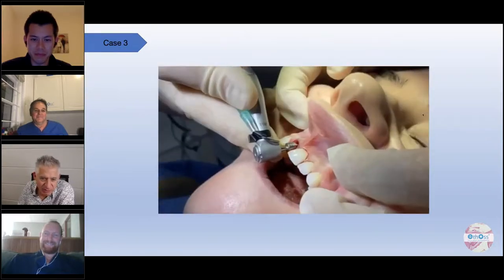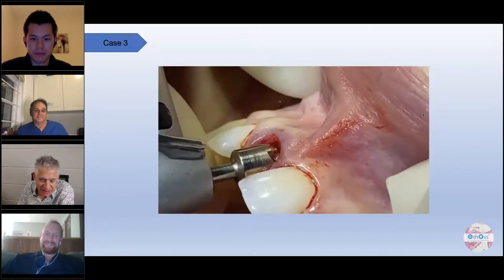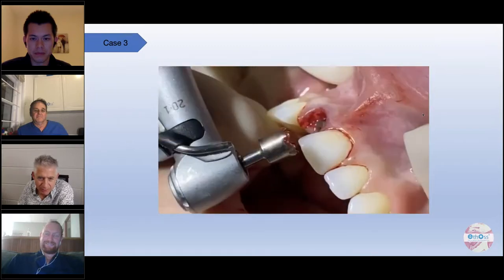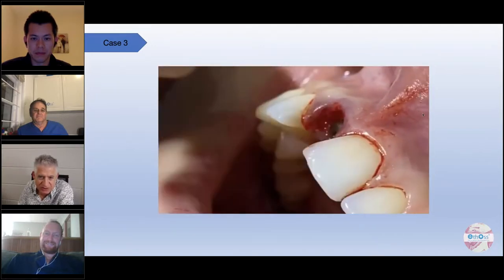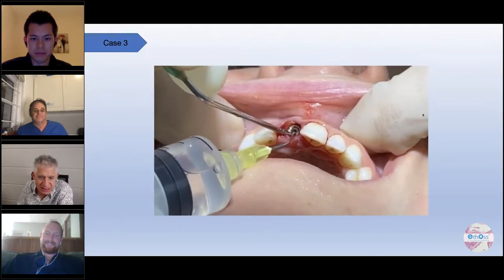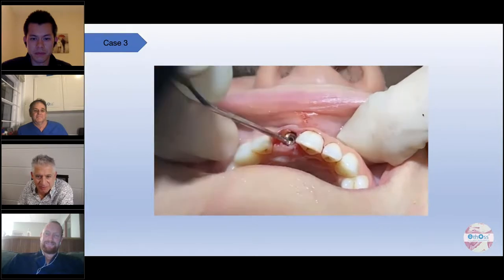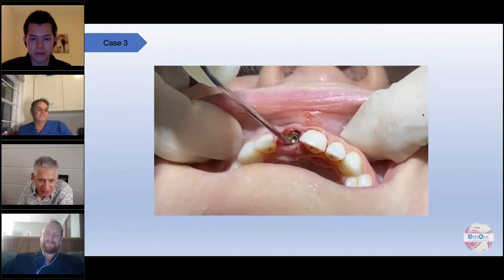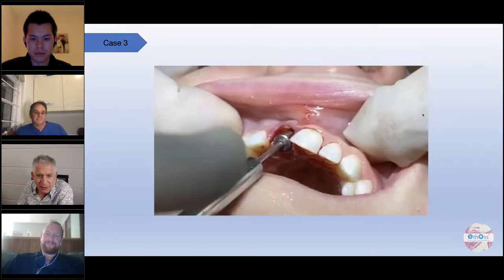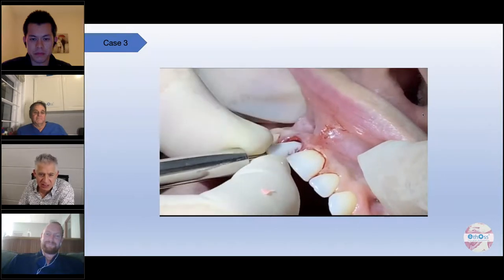And we're going to do a bit of bone milling here because we've gone a little bit under the crest mesial and distal, and we need to get our prosthetic components and impression coping to fit in there. This is the head of the implant. This happens to be an external hex implant. So you see the EthOss on the labial. And now we're going to put our healing abutment, and we're going to take it off and try in our zirconia cylinder.